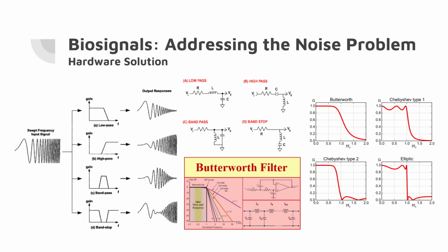The wall that you connect to, like a large plug that powers some of our more common devices we have in the lab, is powered by 60 hertz AC power. That signal can sometimes be picked up by some of your signal recording devices. This can also happen due to the lights in your room, which can create another source of noise. But the problem with the lights is that those aren't necessarily going to be at 60 hertz. You have to know what kind of light is in the room that you're working in to know what frequency of noise you're going to be getting from that light. Nonetheless, there are certain approaches that are taken when trying to address this problem of filtering.